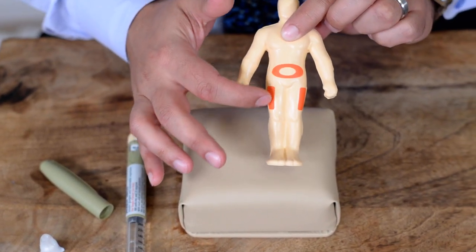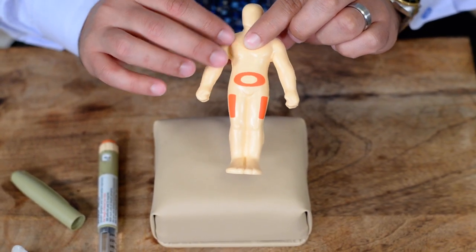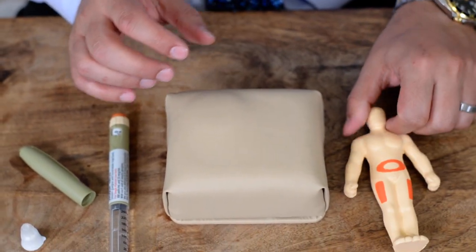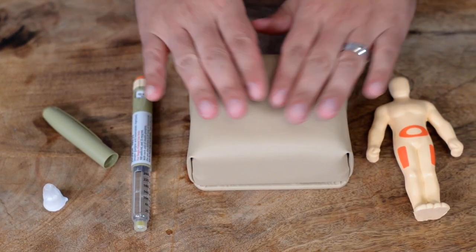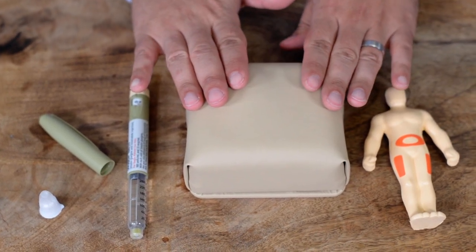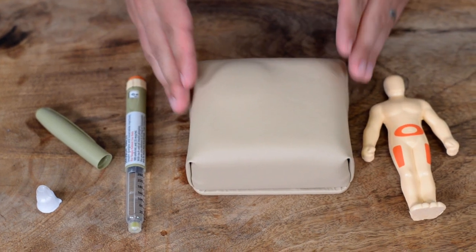As you can see on this model, you can inject on your thigh, on your abdomen — sparing the umbilical area — the back of your arms, and the upper buttocks. Make sure the area is clean; if you haven't showered recently, you can clean it with an alcohol swab, though that's not absolutely necessary since we do not go too deep into the skin.